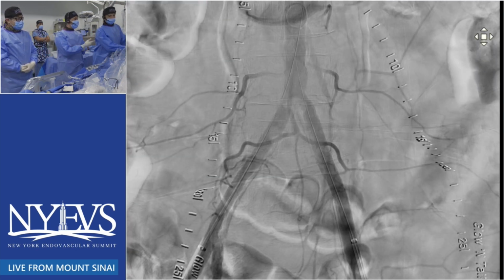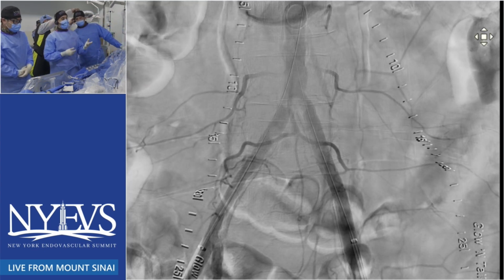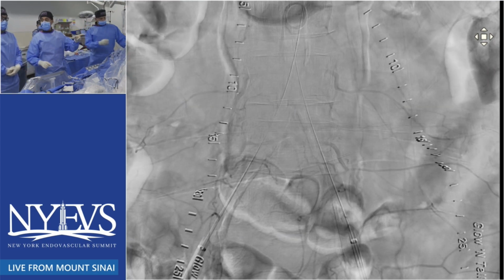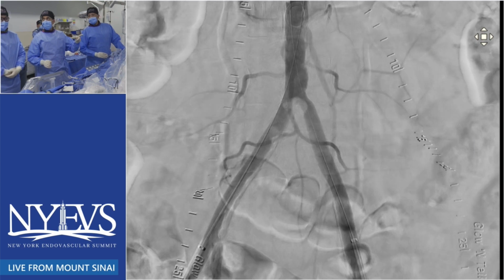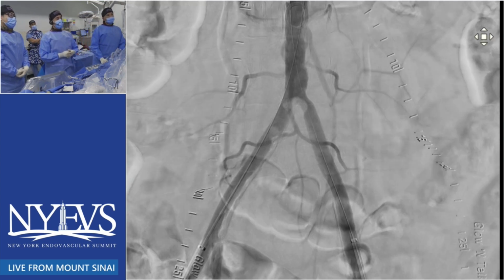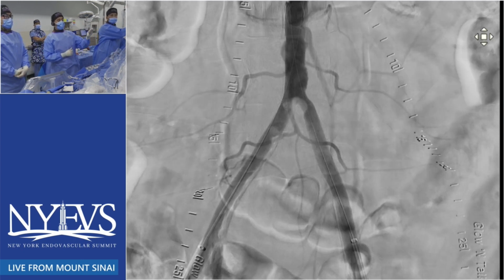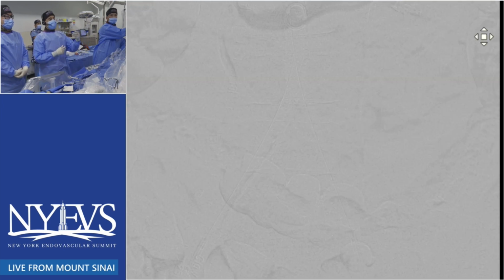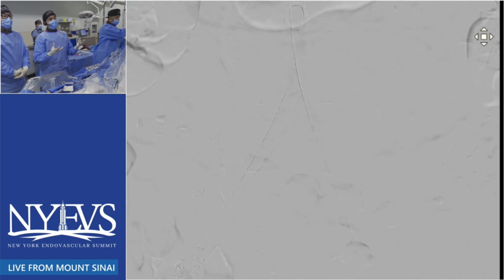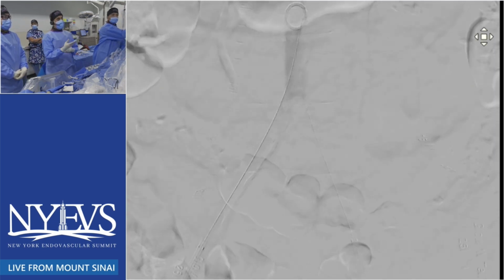Perfect. So we actually did the IVUS measurements on both sides. Let's start with the pictures first, and then we'll go over it. Can they see our pictures? Yeah, we can see your pictures. So this is the angiogram. You can see it's significant disease, significant calcification on the left common iliac, and also involving the right side. The right side has essentially 2 spots, but overall it's a very calcified lesion of the iliac. The rest of the iliacs look beautiful, especially the luminography per se.